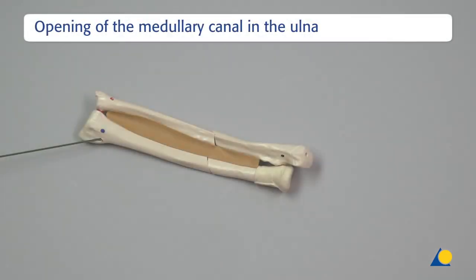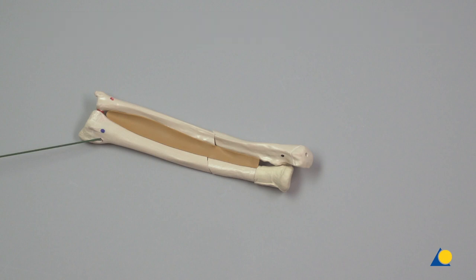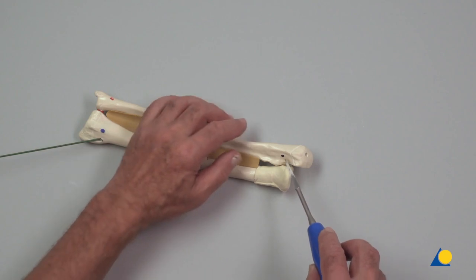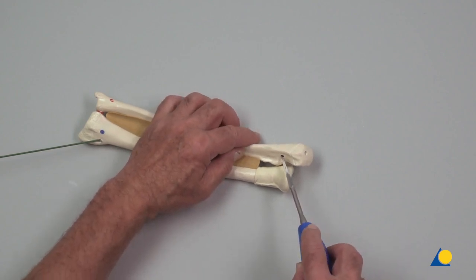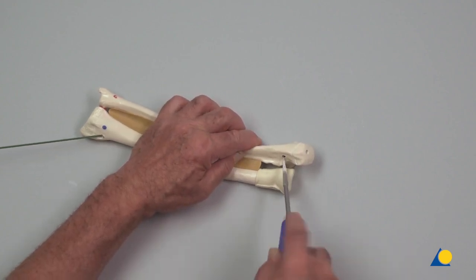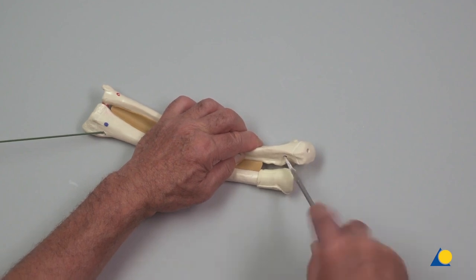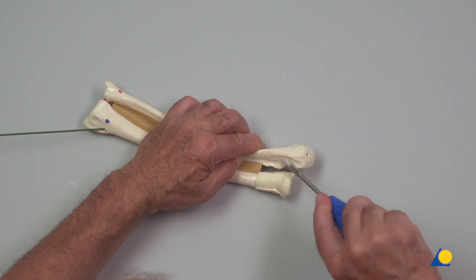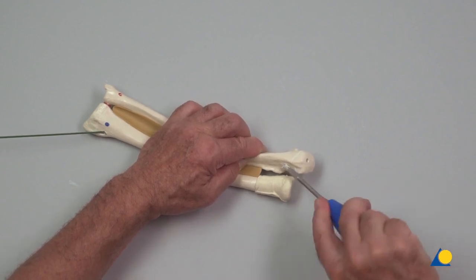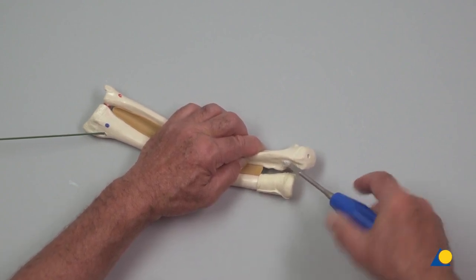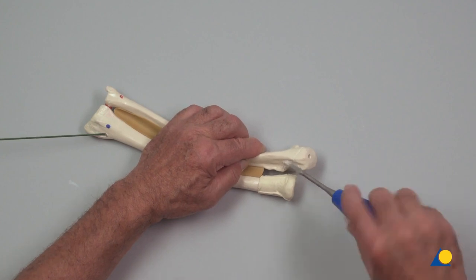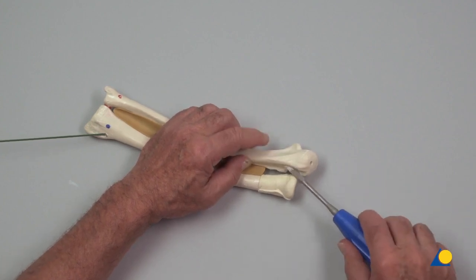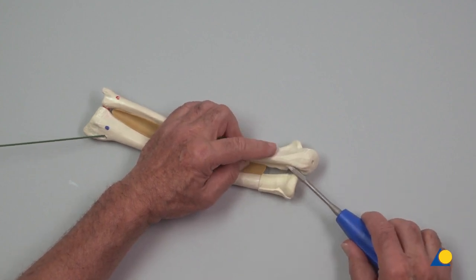Opening of the medullary canal in the ulna: the awl is inserted perpendicular to the bone and a central mark is made with oscillating movements. Once the awl has secured a purchase in the bone, it is lowered to an angle of 45 degrees in relation to the shaft axis and the bone is perforated at an upward angle. It is crucial not to penetrate the opposite cortex.